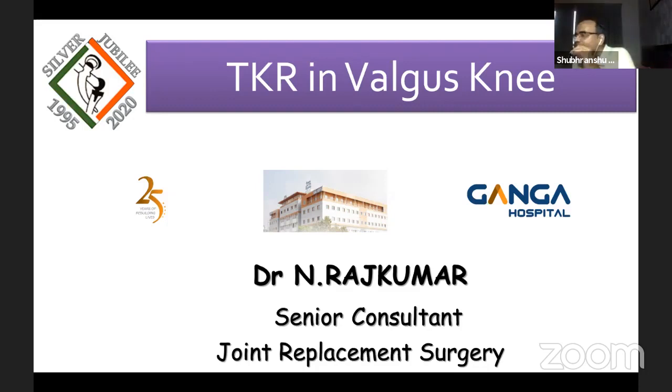Okay. Dr. Anupam Srivastav, can we decide pre-op tibial slope? Yeah, so we have to see the X-ray. If it is a recurvatum case with valgus, it will have a neutral slope. We can determine that with CAS, but a routine case like the one I showed will be 3 to 5 degrees for a PS knee.